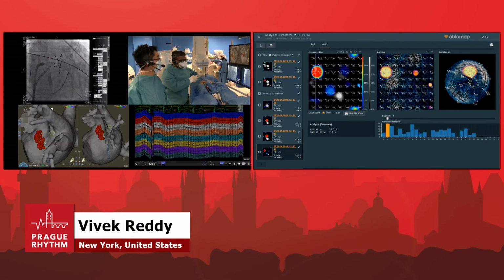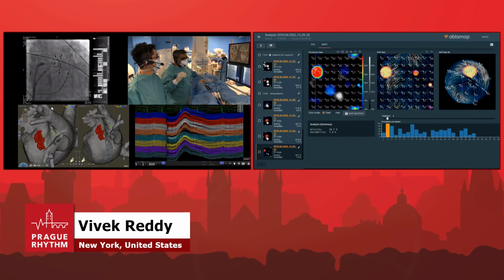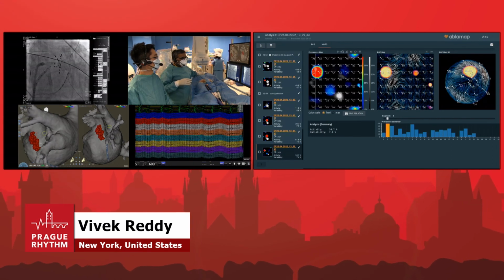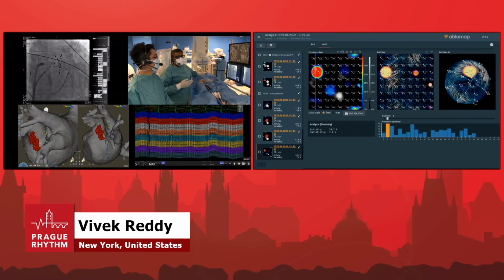Let's say we're going to make some lesions. The dot's going to disappear. Okay, I'm confident about that. I'm not confident that the AFib will terminate. It may or may not terminate. We may end up cardioverting. And I'm sure that you're thinking in the audience, well, what's so great about that? You didn't terminate the AFib.